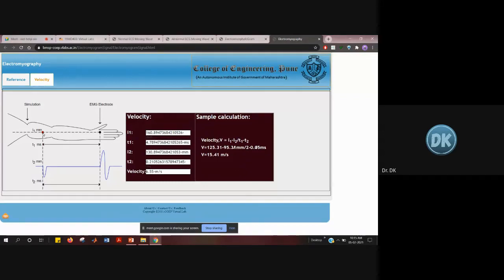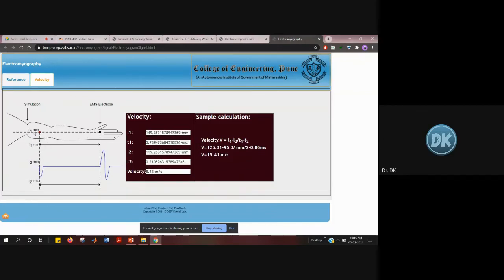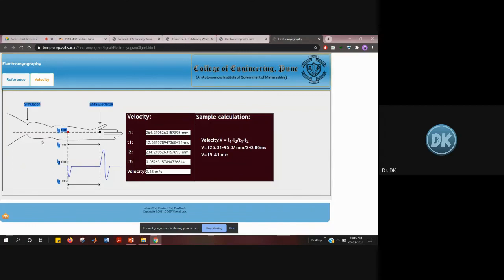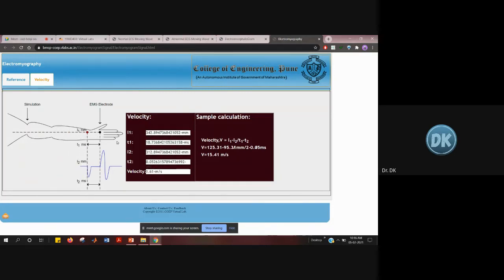Here you can see the electrode being moved. The red one is the electrode where the electrical stimulus is given. You check the time, latency — which is the time delay — and the velocity, all of which are calculated here. You keep the electrode at each point and note the time duration. This is the third experiment.